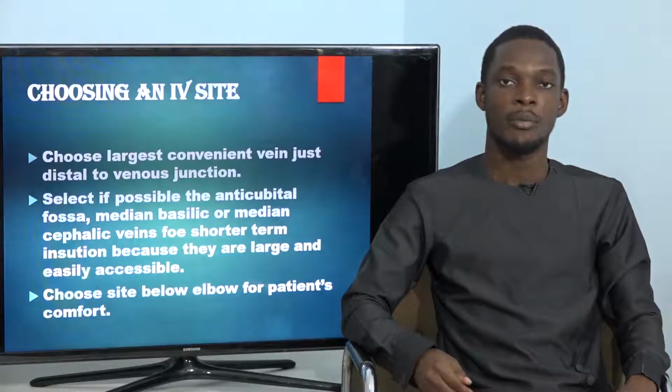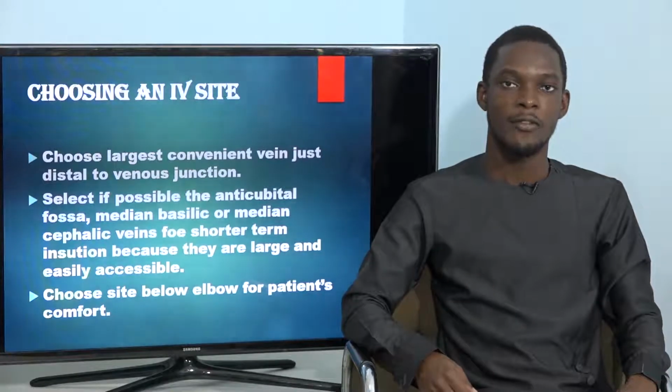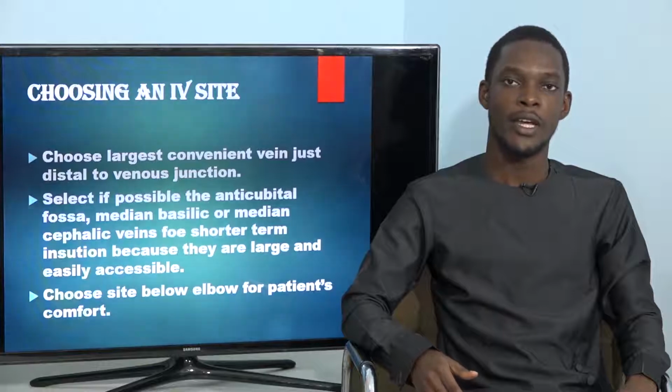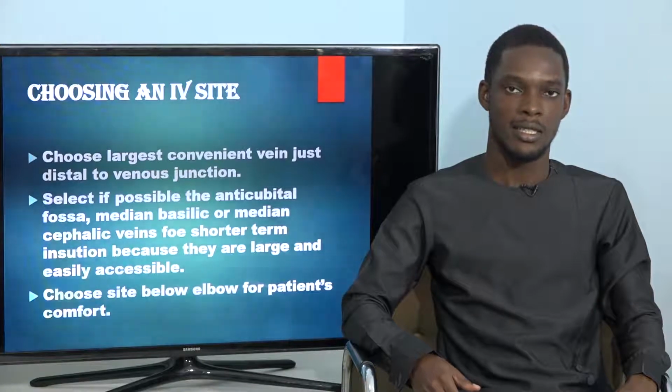Subsequently, if you are pricking below the level, that prick may be self-defeating. It is therefore necessary to prick from the fingers first, and you move your way up slowly towards the elbow until IV access is attained.